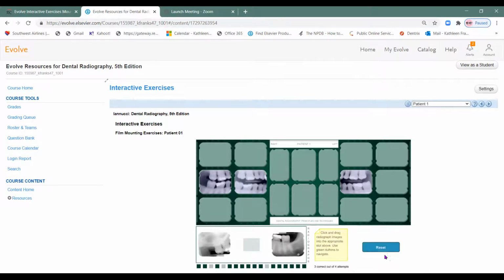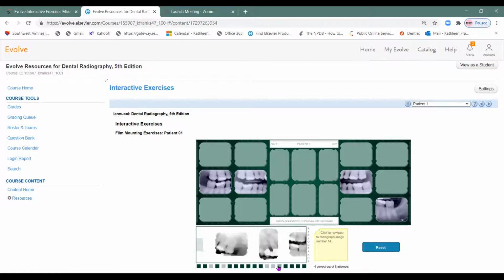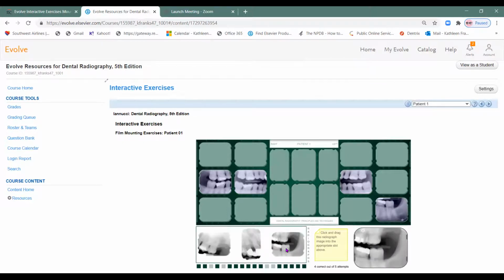So here, I know that that's a mandibular molar shot because it has 2 roots on it. And if you look, it still has that curve of Spee that goes like a smile. I'm going to put it here so I can show you. I can match up this tooth number 19, which has this amalgam filling, and I can see this amalgam filling right here. Okay, so I still want to find my other bite wing. There it is. Okay, so we have 4 bite wings.